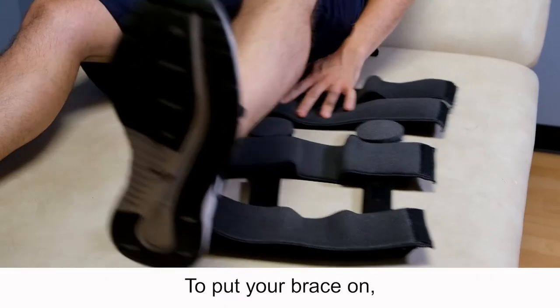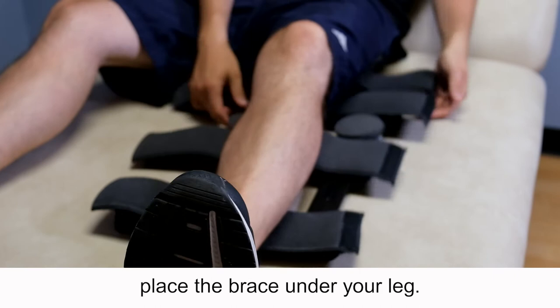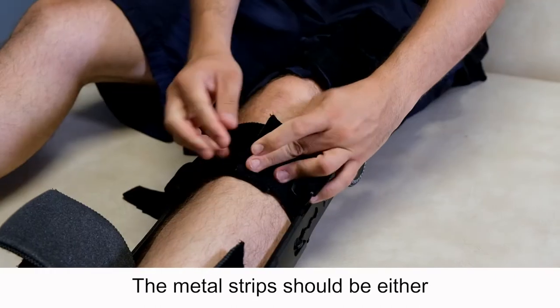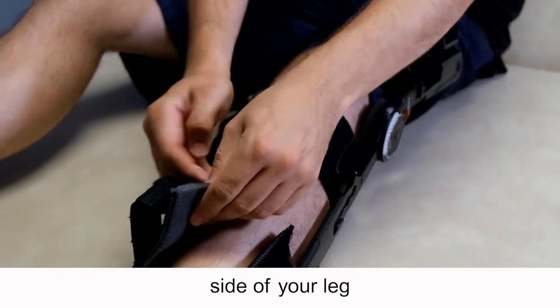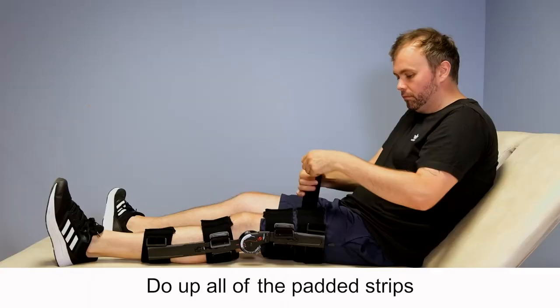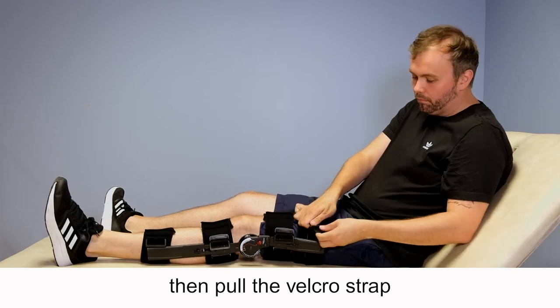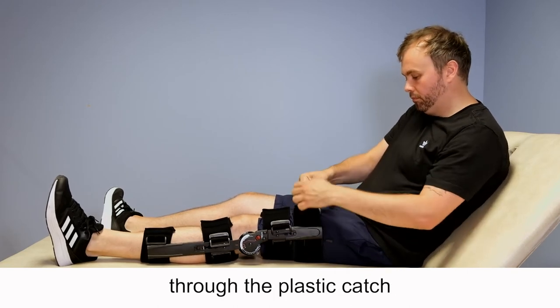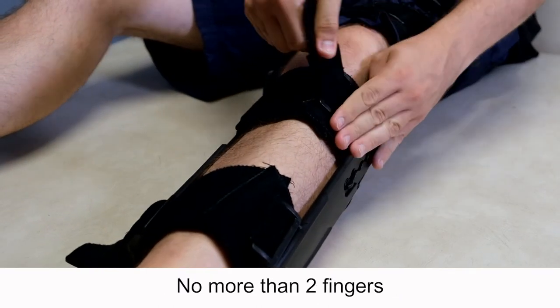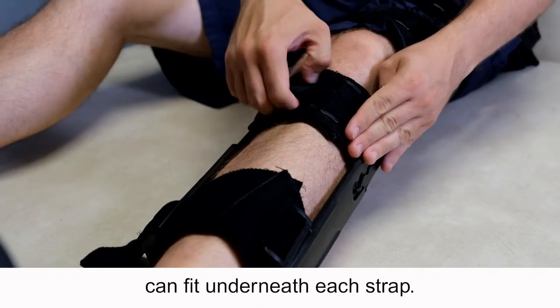To put your brace on, place the brace under your leg. The longest straps should be at the top of your leg. The metal strips should be at either side of your leg with the hinge part level with your knee. Do up all of the padded strips then pull the velcro strap through the plastic catch and stick down. The straps should be tight — no more than two fingers can fit underneath each strap.